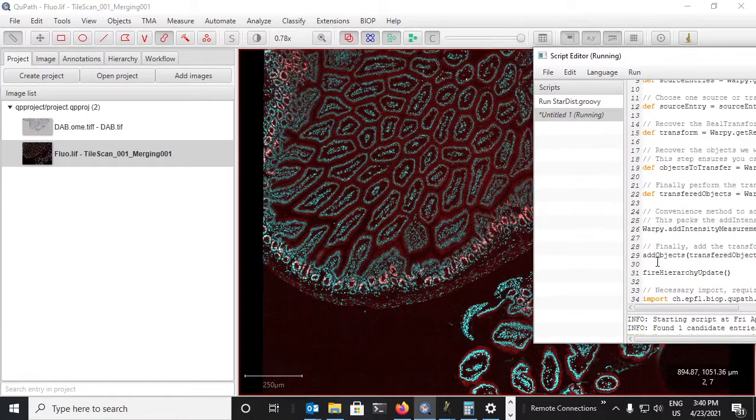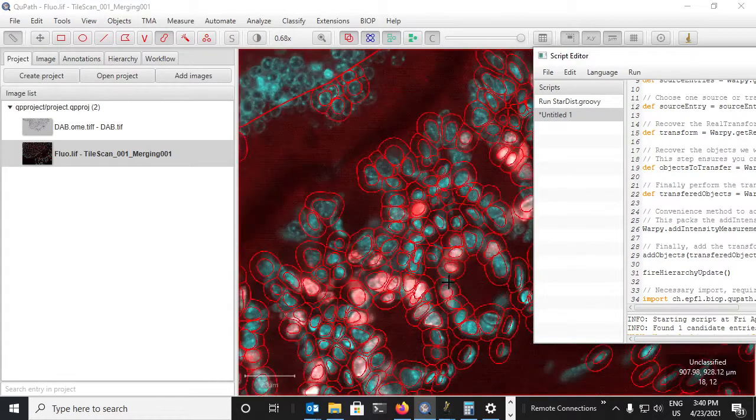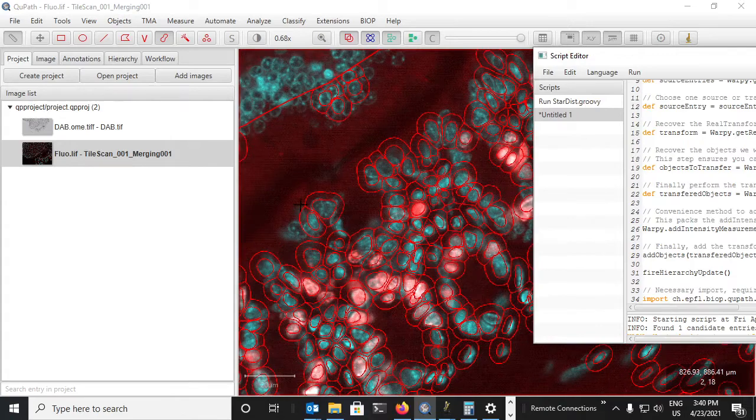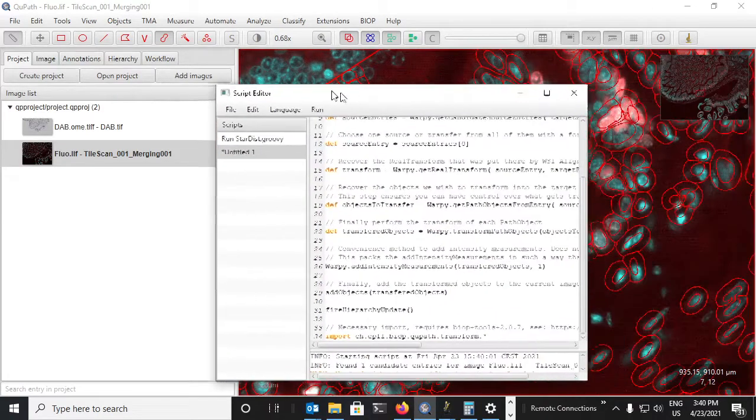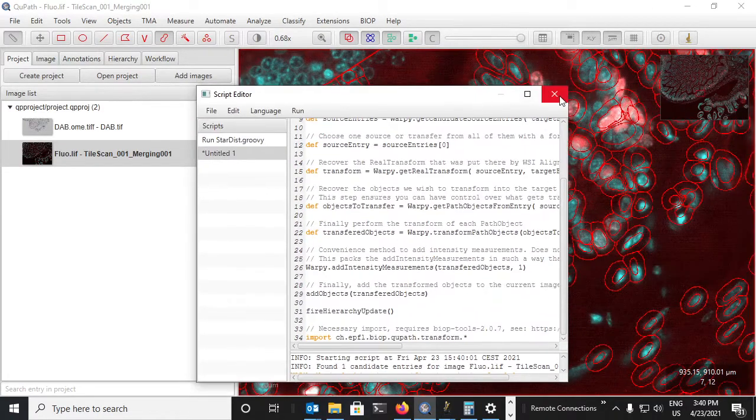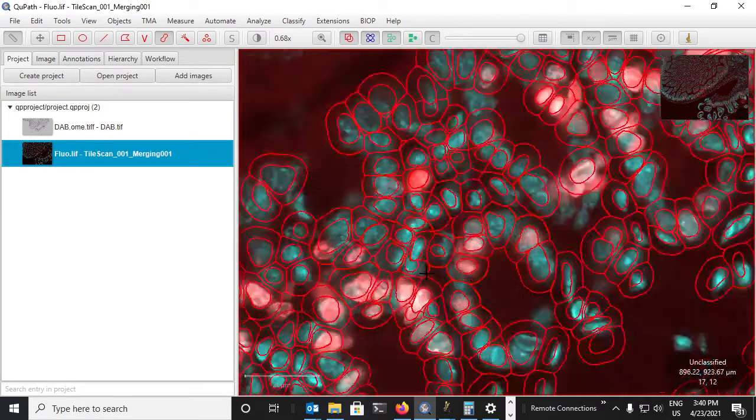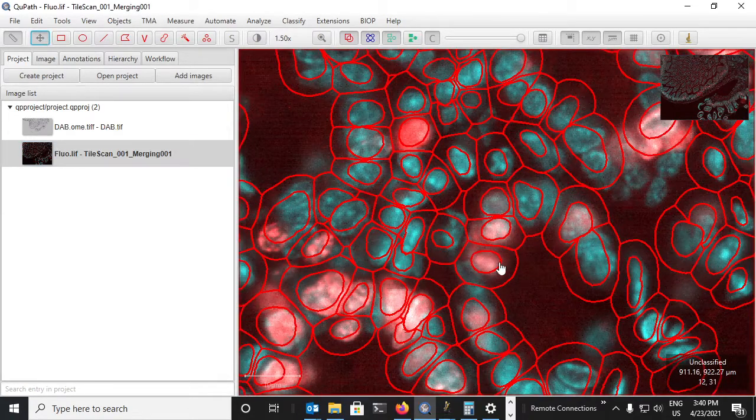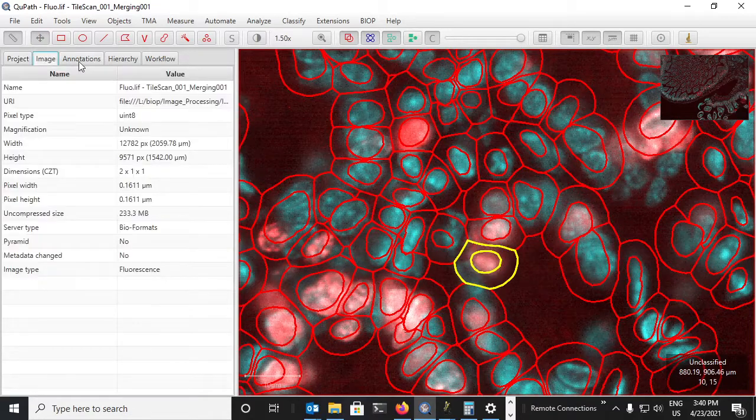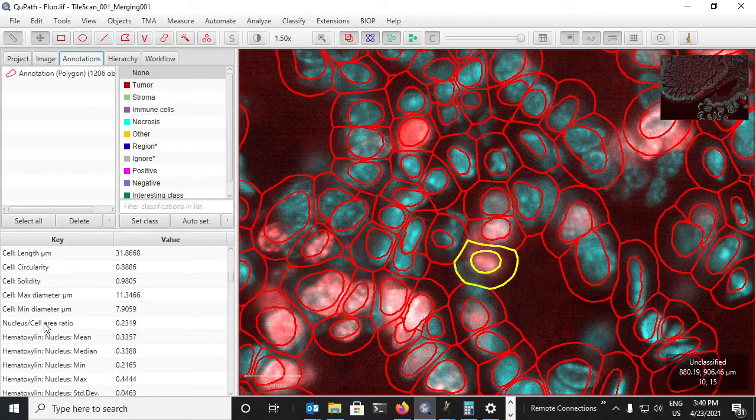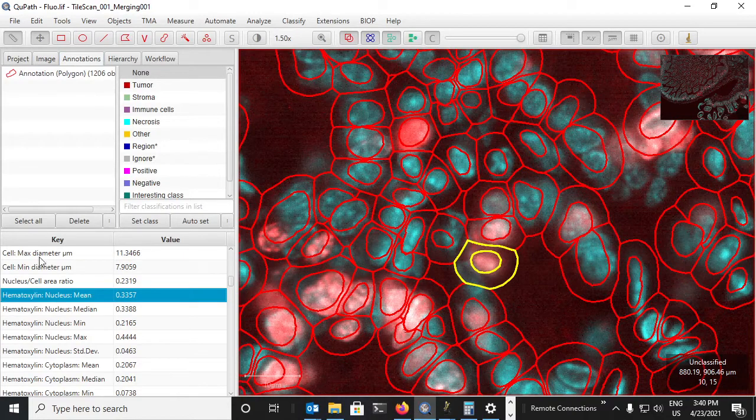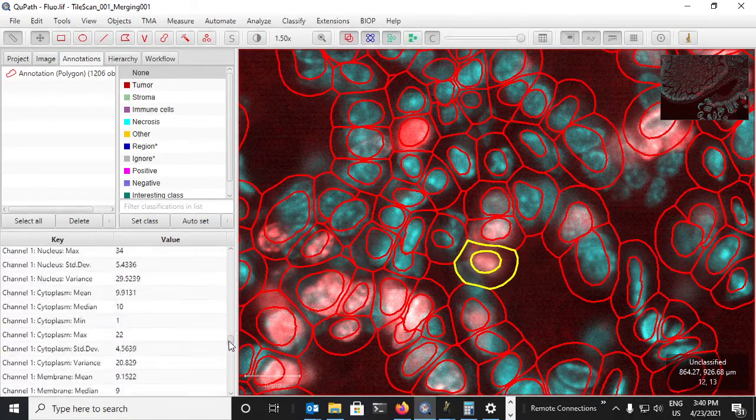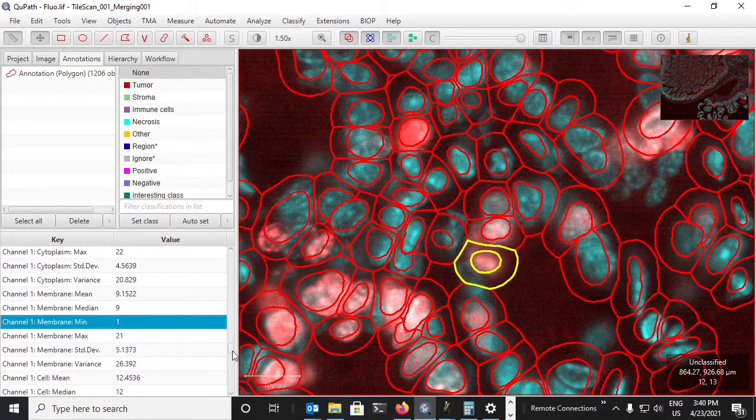On top of that, if I close my script, we can see that every single one of these cells contains the statistics from the DAB image and now also the statistics for channel one and channel two.